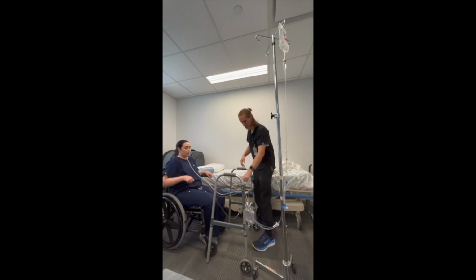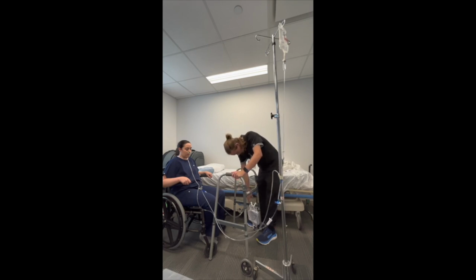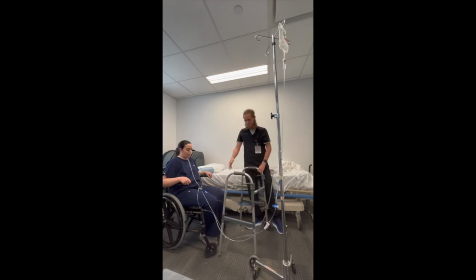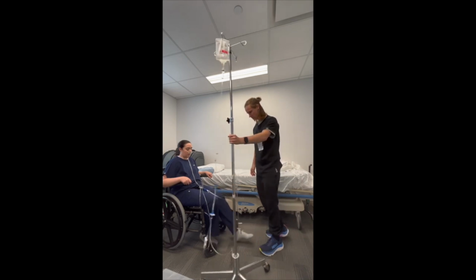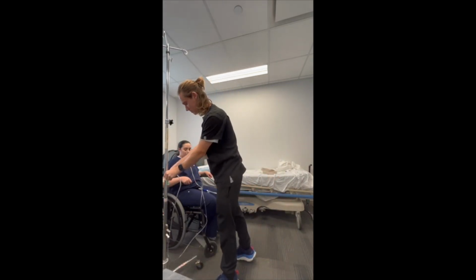And then last thing, you want to make sure that all these lines and tubes are set up the way they were. So we don't want to pull this away because our Foley catheter is still set here. So we're going to instead bring this over. We're going to untangle our makeshift holder, and we're going to set this up on the chair here. We can now pull this away, making sure that our lines are clear before moving anything, including the assistive devices. We're going to plug this back into the wall, including our oxygen.